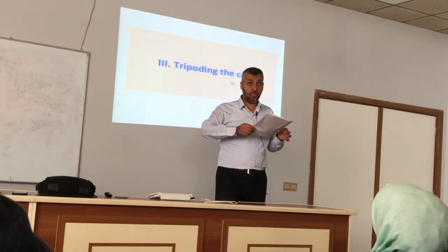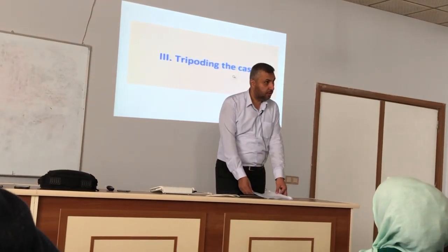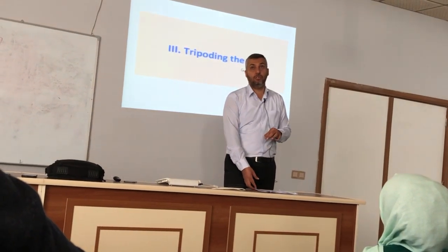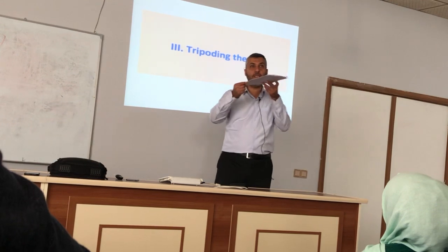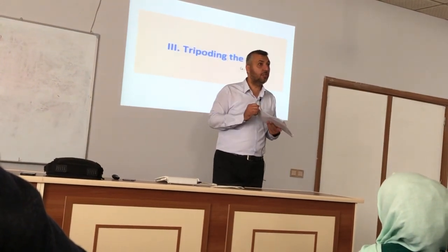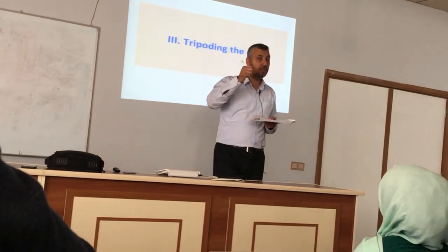After that, once I want to return it to its position, it will never sit 100% in the same position. A slight change, 1 millimeter, 2 millimeters, will change the entire design. Why? Because it will change the survey line.